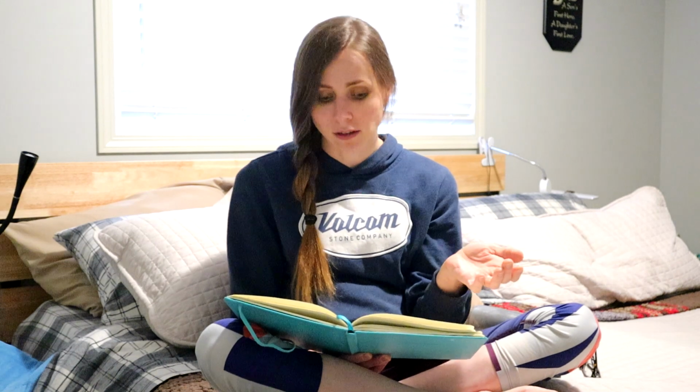Another thing that's good about it is that it's reversible. So if you take the catheter out, the cut that the urologist makes will just grow in. It's kind of like getting your ears pierced. If you take the earring out and you don't ever wear earrings, it's just going to grow in. It's less expensive than intermittent catheterization, just like an indwelling catheter, because you're not putting the catheter in all the time. You're not changing it as often.